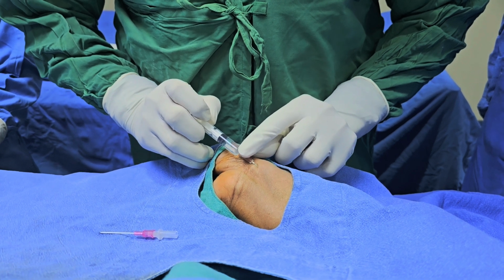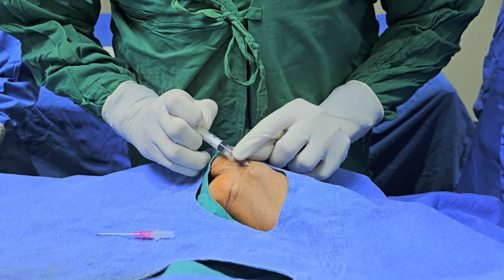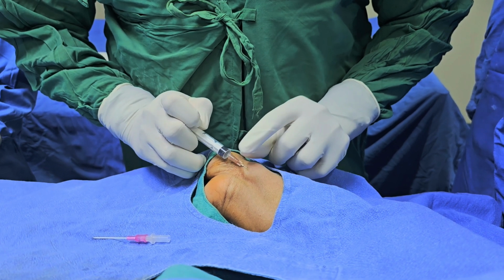At this point, if you have inadvertently punctured the radial artery, don't inject the local anesthetic. Pull back the needle, change the direction of the needle, go deeper, and then inject the local anesthetic. You can see here a wheal is being formed. This is a very important step.